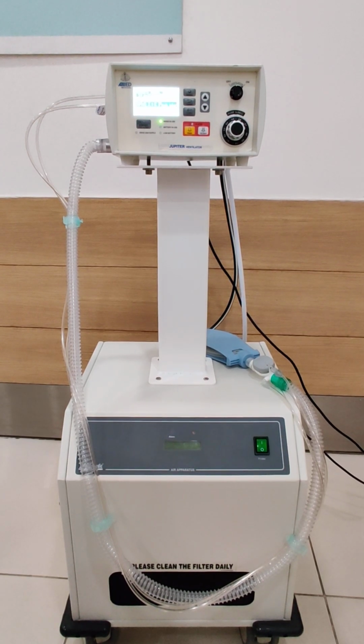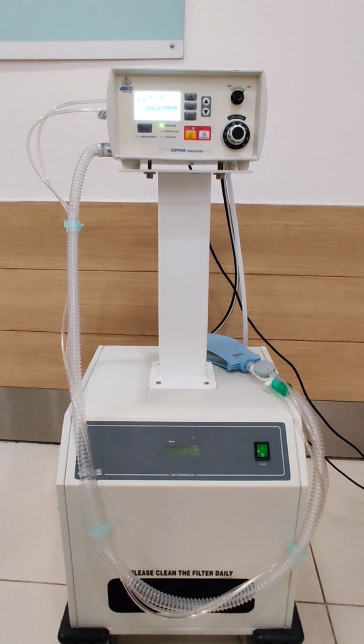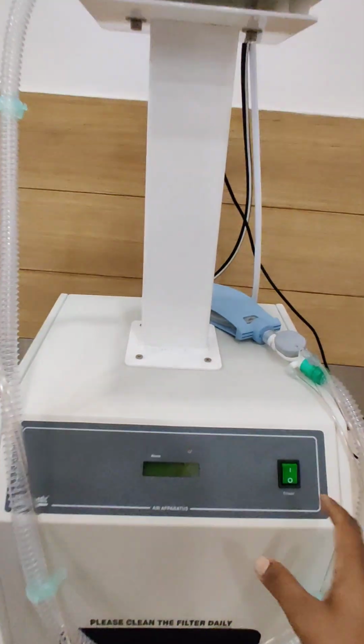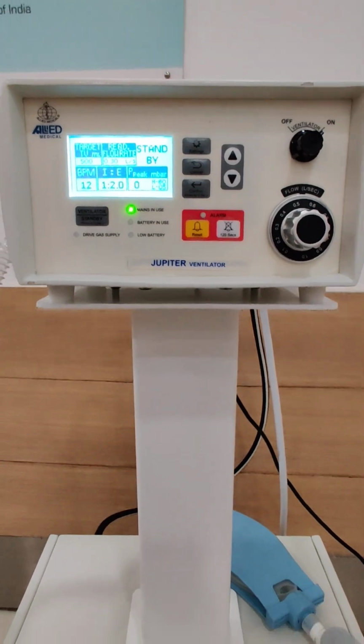So this is our Jupiter ICU ventilator. This ventilator comes along with the compressor, and this is the compressor unit, and the ventilator is mounted on the compressor unit itself.